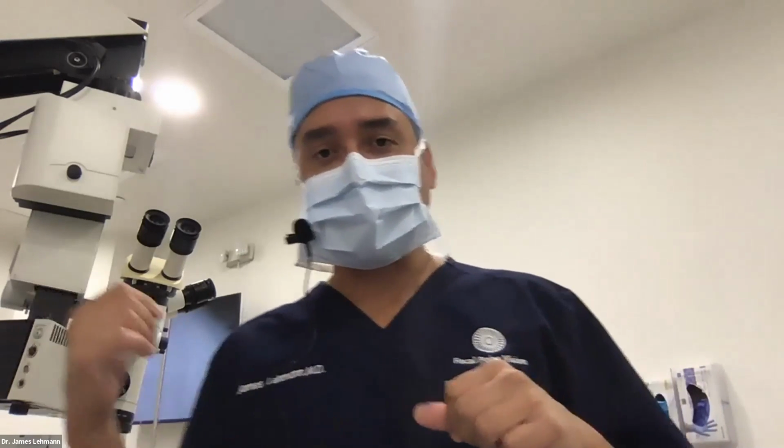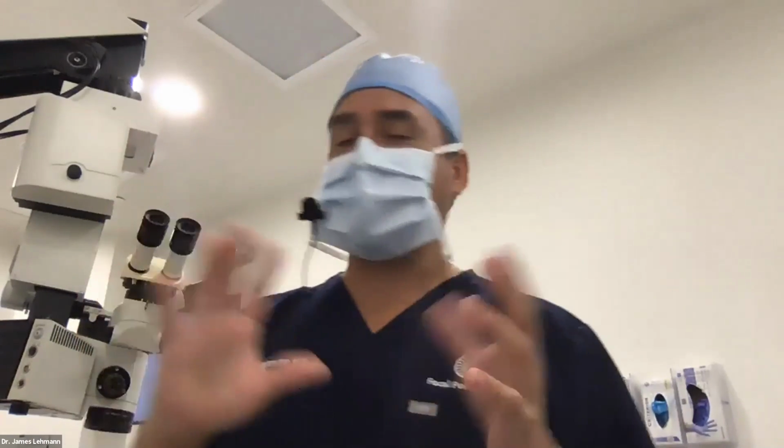Dr. Turtag asked, do you use intracameral antibiotics? Yes, we use Moxie. And Dr. Suresh Kumar Jirwal is asking, was the surgery performed under topical anesthesia? Yeah, that was topical anesthesia. The next one will be local because she was very much more sensitive and not a very good patient, which I'll get into in the lecture.